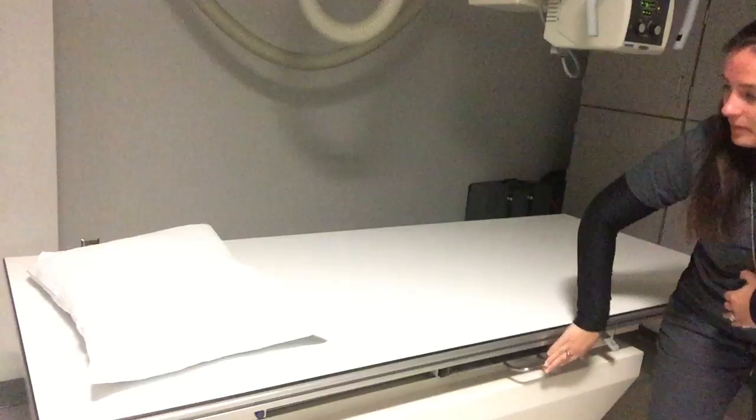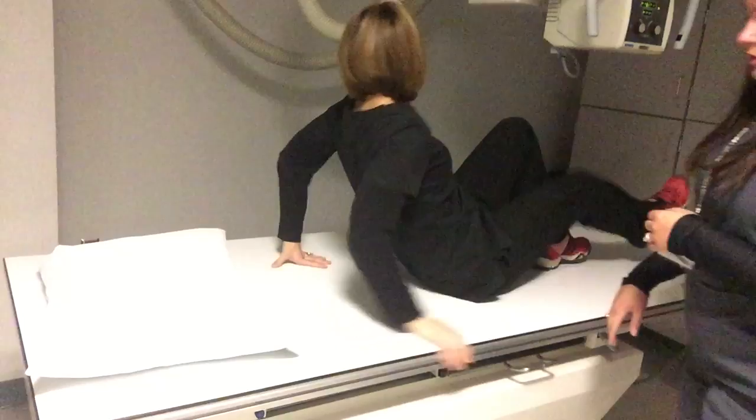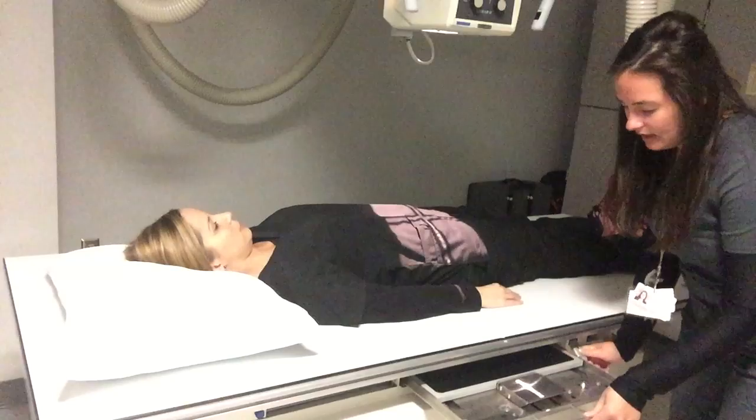I'll have my patient come on around and lie down on her back. Now, you all may recognize this projection as a KUB, but in this particular situation where we've got barium introduced into the colon, we're just going to refer to it as an AP. I've designated it as supine because we may also, during a procedure like this, do an AP upright.